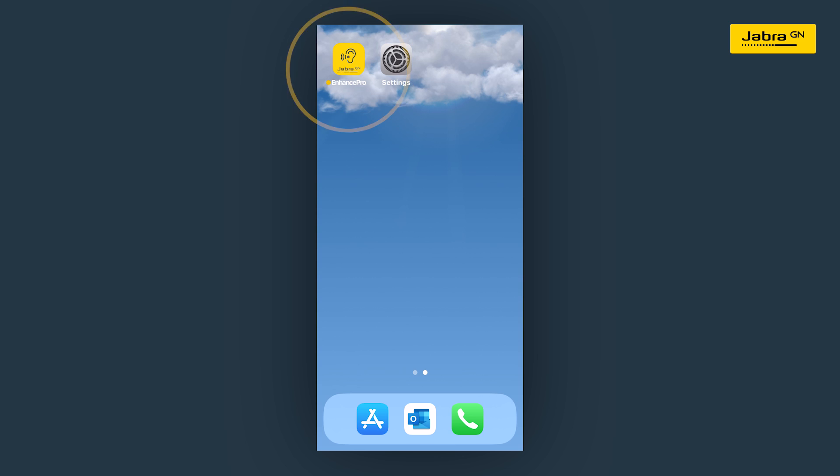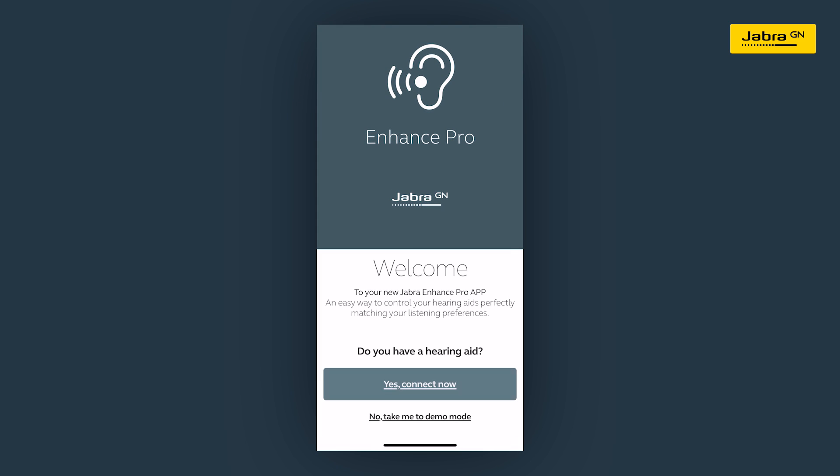Tap on the Jabra Enhance Pro app icon on your iPhone. This will bring you to the welcome screen. It will ask if you have your hearing aids. Tap on the blue box that says yes, connect now.